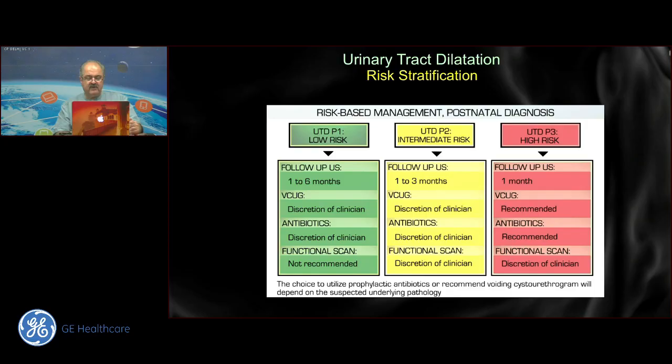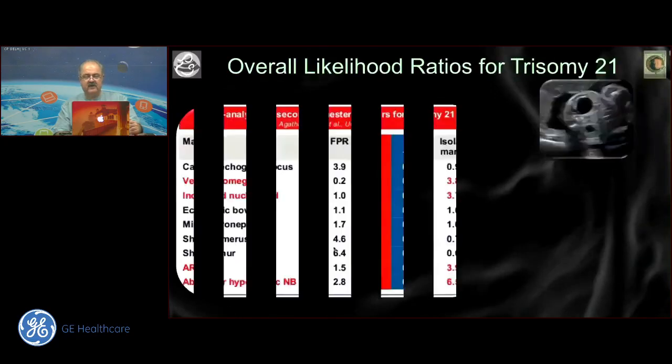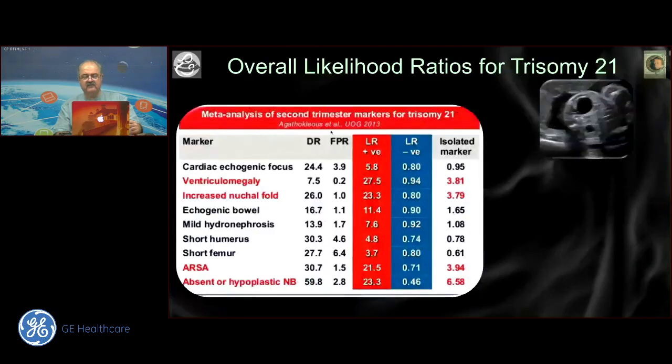What I'd like to do is to point out once again that we always, for trisomy 21, I use the Agathokleous chart from 2013, where we use any a priori risk available. If I find this at the time of my genetic sonogram, I find out whether I have a risk from my first trimester biochemistry, a risk from my first trimester ultrasound, a risk from a quadruple test, and so on, and then I look at this. Of course, if I've had an NIPT done, then I don't look at these at all, just like we do for any of the other things when I do an NIPT.